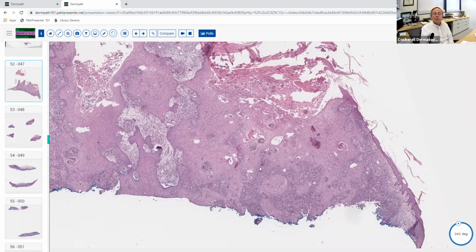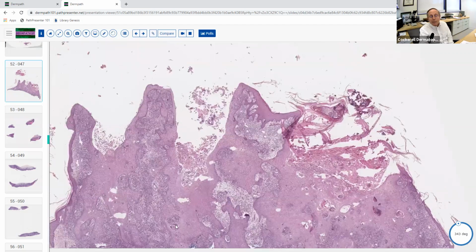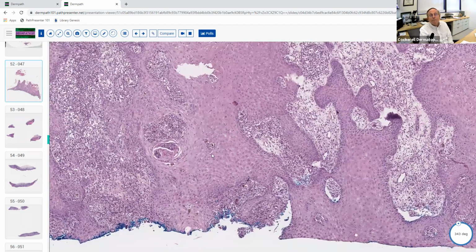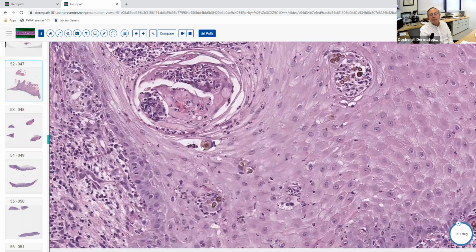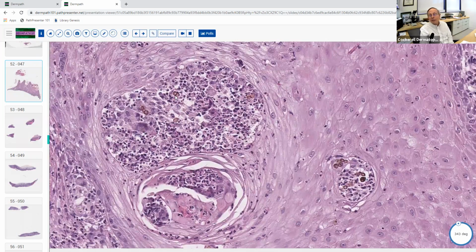So you say, okay, if it's an infectious process, where am I going to look? Well, there are several places to look. If you have abscesses in the epithelium, that's a great place to look because that's where the infectious organisms often get transepidermally eliminated. And lo and behold, right in this little abscess, there are these copper pennies, medlar bodies, sclerotic bodies of chromoblastomycosis. They're actually not just here, they're all over the place. So anybody that's not visually impaired here should be able to diagnose this and get this right.